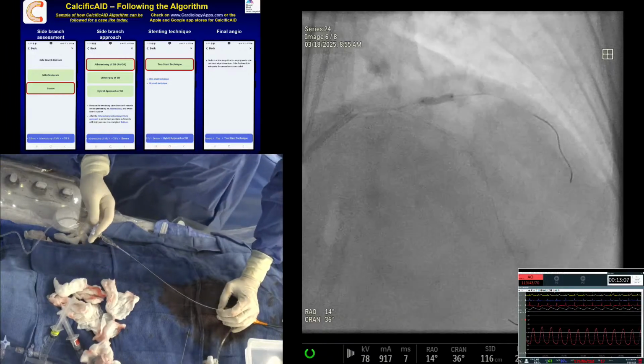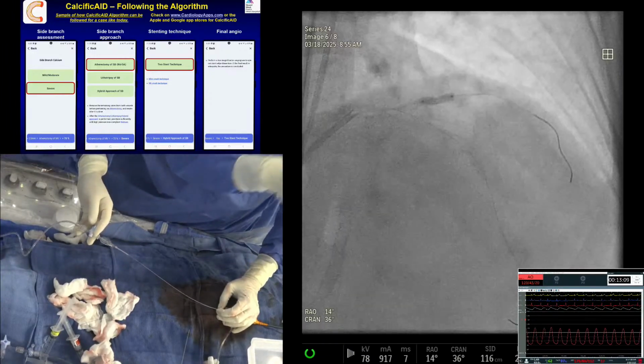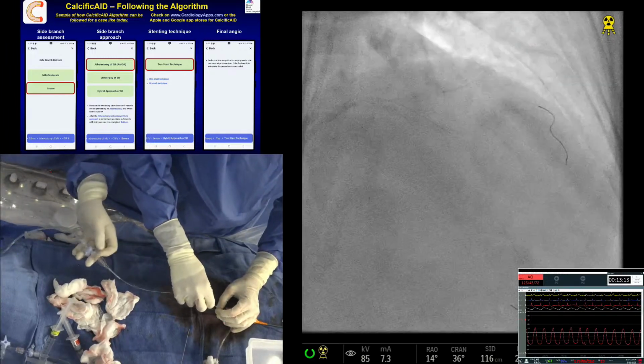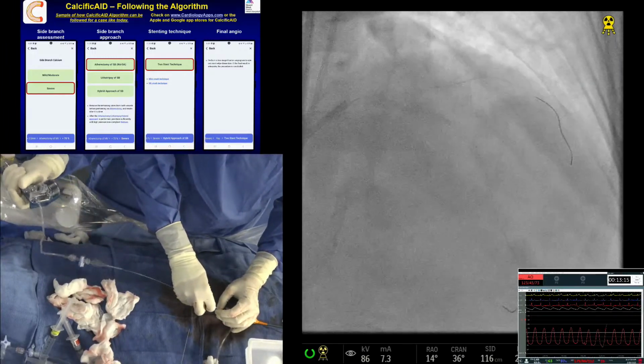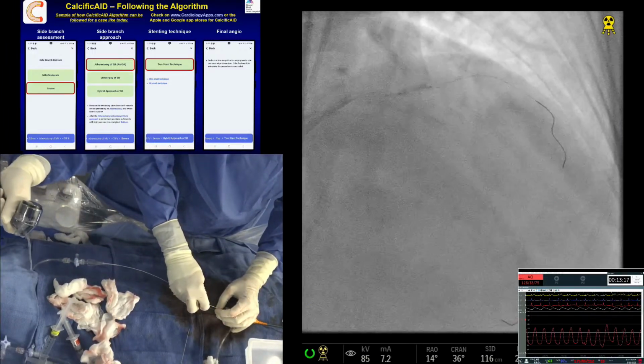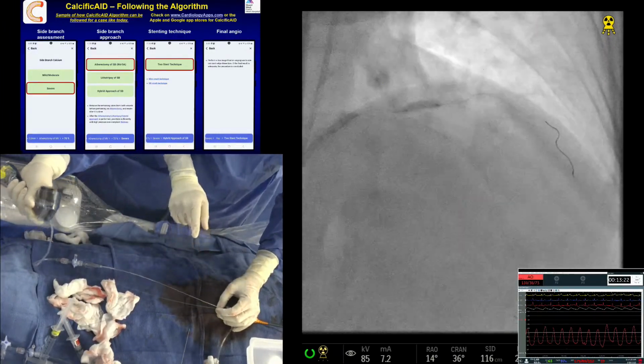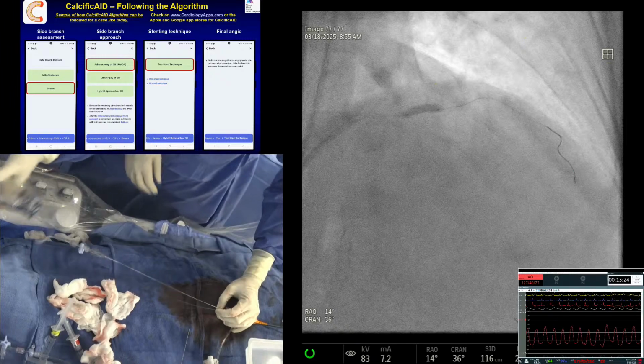Remember at the level of the diag, we have to be in between. Yeah. That's fine. Between us two, let us make the diagonal first. Yeah, that's fine. So make us 33. Yeah. Pull back a little bit more. No. Yeah. 33. Okay. 3O 33. Okay, good. Down. I'm not doing bifurcation here. Why? No, we're not doing mini crush. Okay. Leave it.